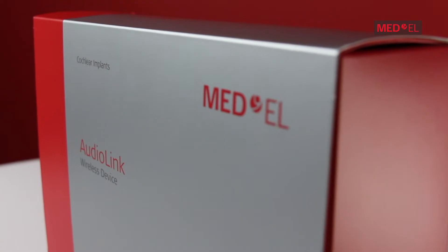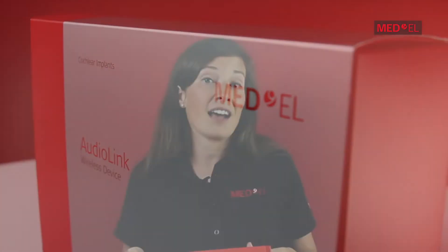AudioLink is an all-in-one connectivity device that can pair to the Sonnet, Sonnet EAS, or Sonnet II. Once you receive your AudioLink kit, everything you'll need will come with it. So let's take a look at what's inside.